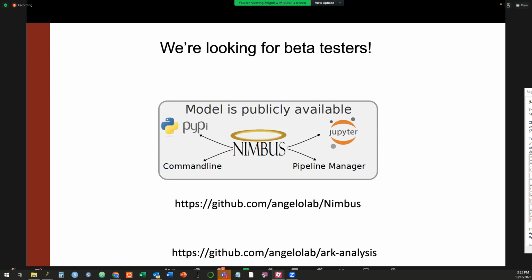Yeah, great question. So, the classification task is binary yes or no, but cells are not binary yes or no, they're on a spectrum. Actually, what we return is the probability. So this Nimbus score goes from 0 to 1. So we are not thresholding it to tell you if it's positive or negative. The output of the model is, and the deep learning people will be mad if you call it probability because it's not technically a probability, values that range between 0 and 1, where 0 means no and 1 means yes, and that is what we return as part of the model. So then you can decide what threshold makes sense or use it as a continuous score.